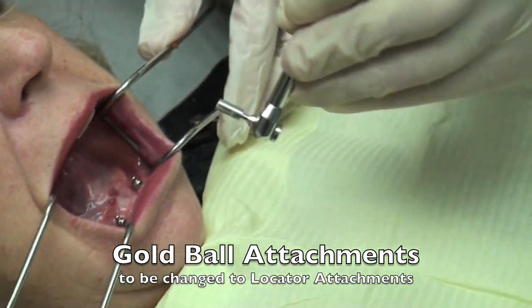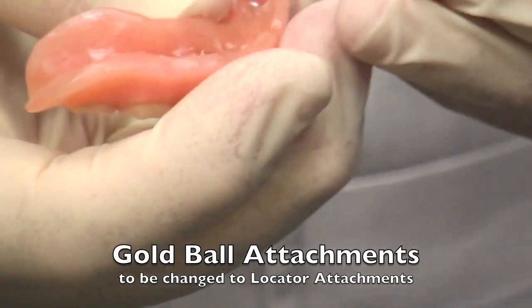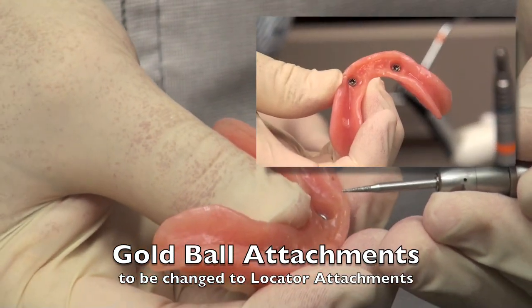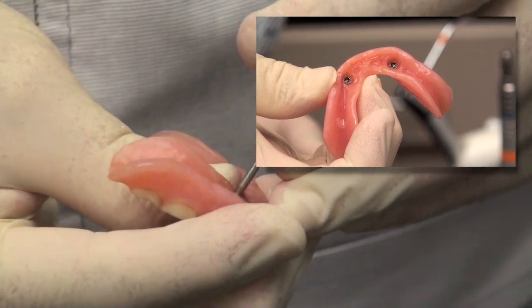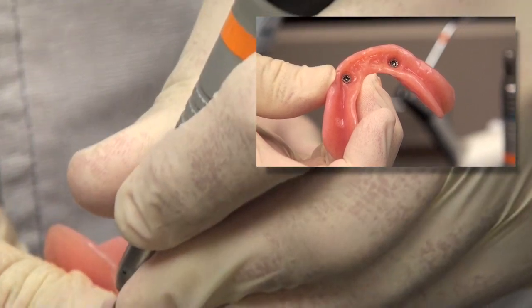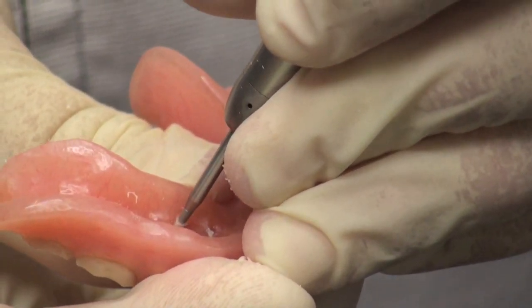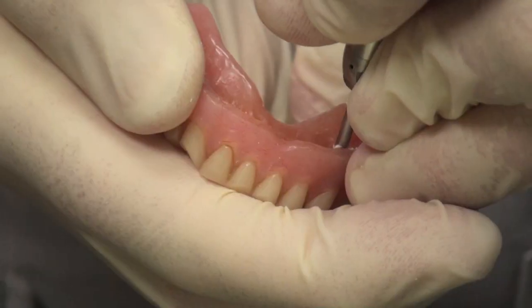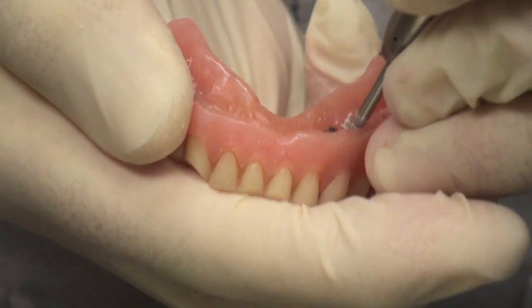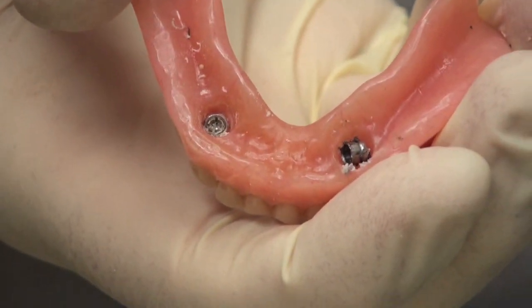Our patient has been wearing a denture with some ball attachments over the past five or six years. These have gradually become a little bit loose, so today what we're going to do is take these ball attachment housings out, take the ball attachments off the implants, then place some locators on, and then come back in and add the locators into the denture chair side.